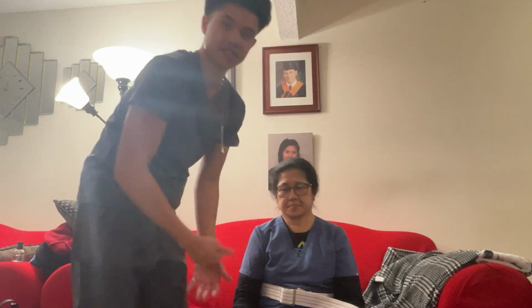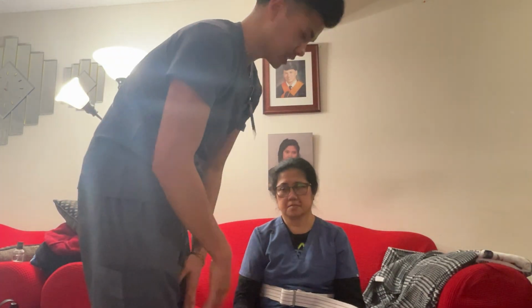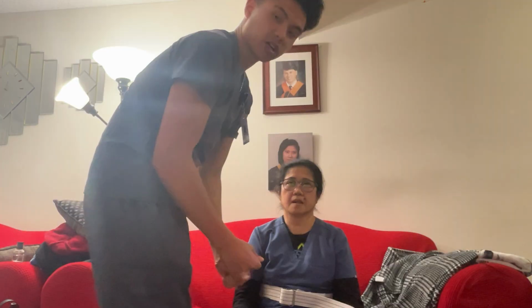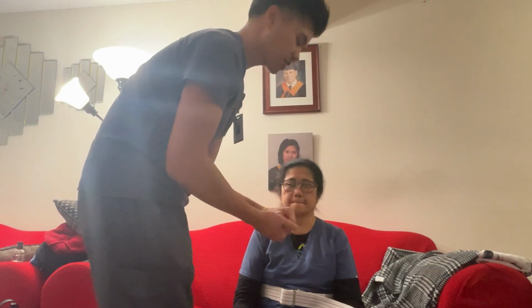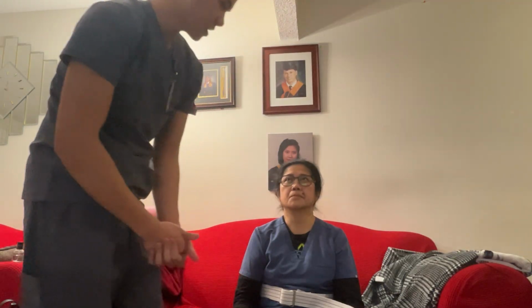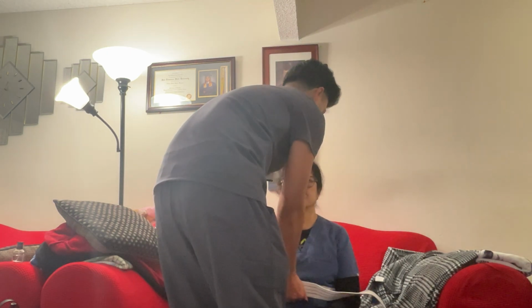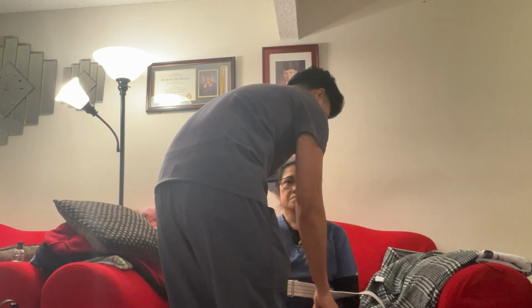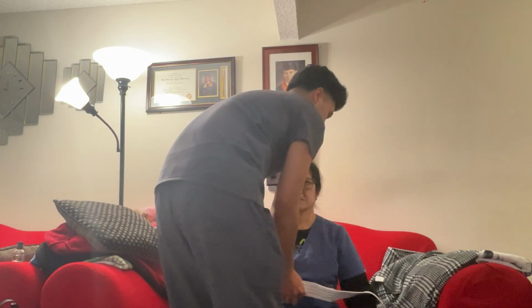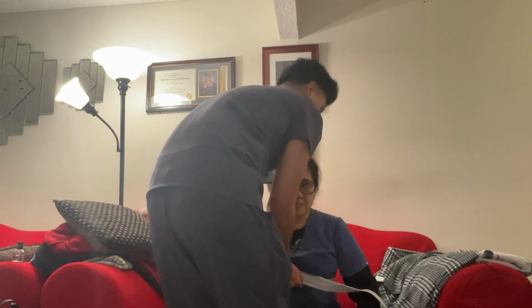So now that the patient has confirmed that they're okay, now I'll be standing in front of the patient, and then we'll be rocking for about 3 times and then lifting them up, ensuring that I'm facing the patient and standing right in front and not to the side. Okay. So I'll be standing right in front of you. I'm just going to grab the Gait Belt and we're going to rock for about 3 times, and you're going to push off from your hands, and I'm going to help lift you up. Is that okay? Okay. All right. Ready? 1, 2, 3. Awesome.